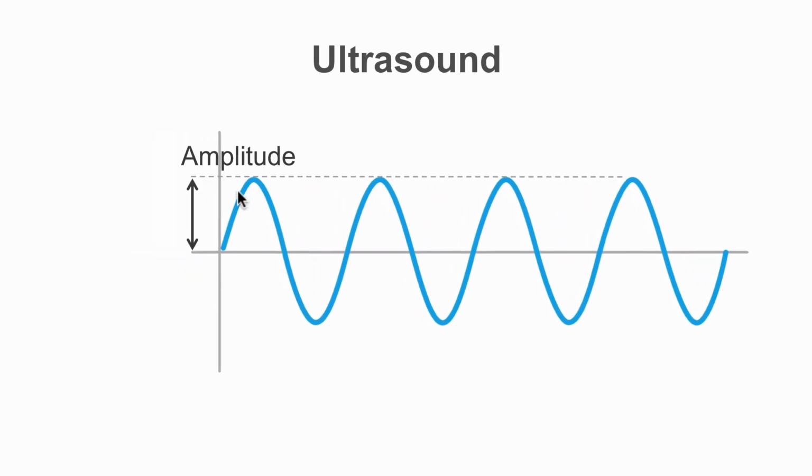can describe the ultrasound by its amplitude or power. And we can also talk about its wavelength. So this is this length here for a whole cycle of the ultrasound. And then we could talk about frequency, which is how many of these cycles we might get in a second. Frequency matters because it affects resolution, with high frequencies giving better resolution. So with high frequencies, there'll be low wavelength.